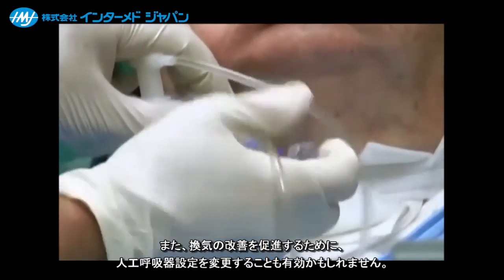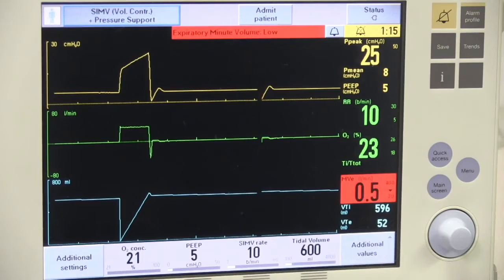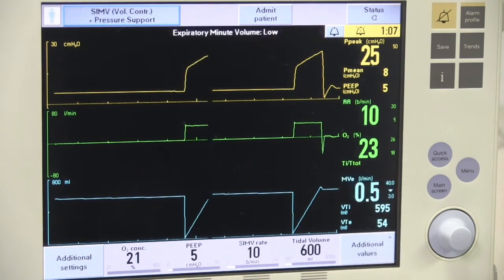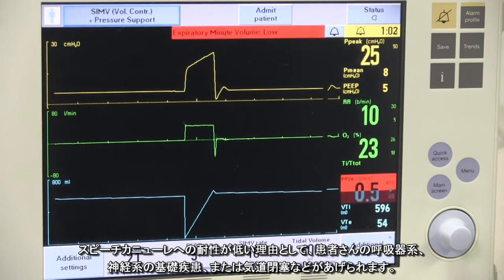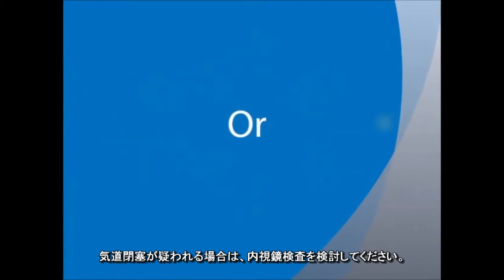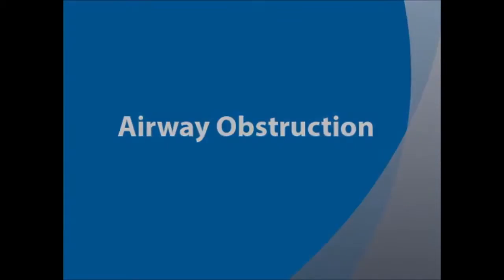It may also be helpful to make ventilator changes to facilitate improved ventilation. If the patient continues to demonstrate reduced upper airway airflow, discontinue use of the speech cannula and reevaluate the patient. Reasons for poor tolerance of the speech cannula include the patient's underlying respiratory or neuromuscular diagnosis or airway obstruction. If airway obstruction is suspected, consider an endoscopic evaluation to rule this out.